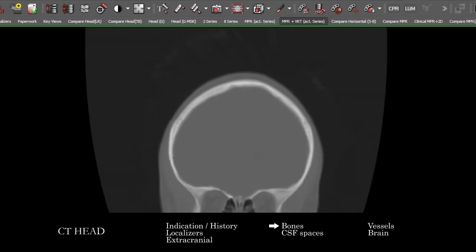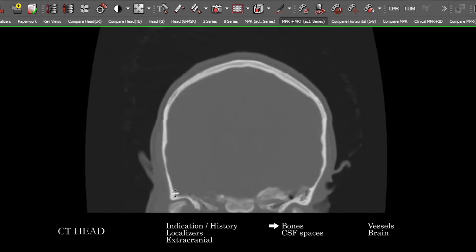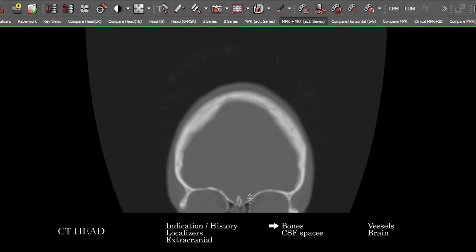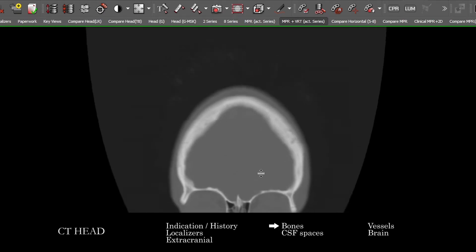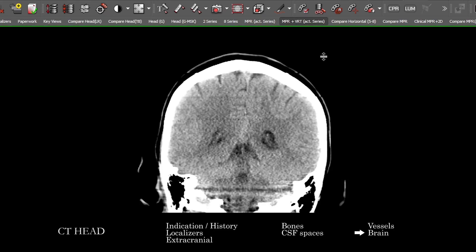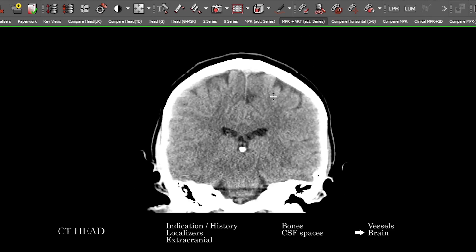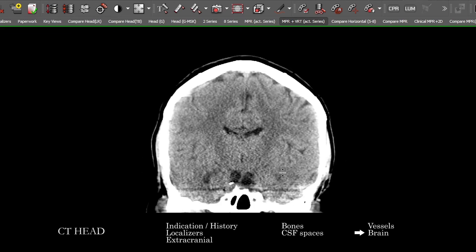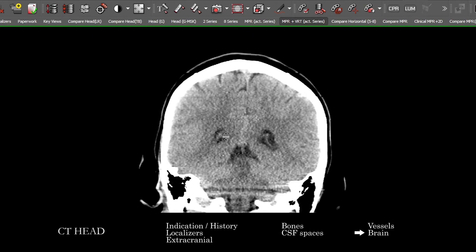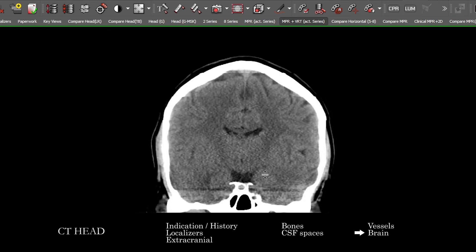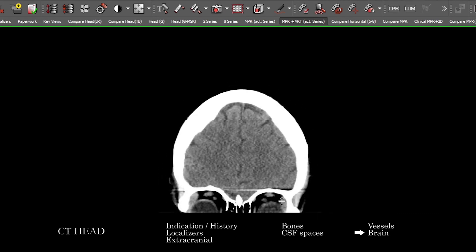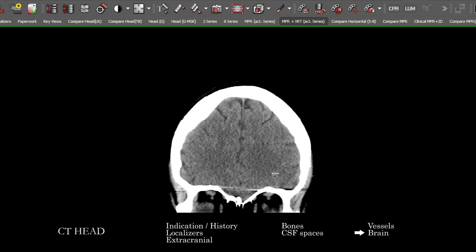I particularly like the coronal reconstructions for the skull base, for the TMJs, for the walls of the orbit, and certain areas of the anterior cranial fossa — the ethmoid air cells, lamina papyracea more anteriorly. Within the intracranial compartment, the coronals are going to be particularly good for abnormalities at the vertex, along the falx, along the tentorial leaflets, and along the skull base, where streak artifact can make it very difficult to see things. You can also get a better look at the intraorbital components on the coronal images.